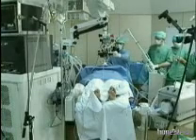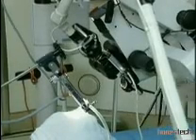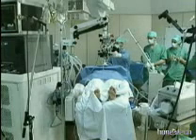The AcuSpot micromanipulator, which is attached to the operating microscope and connected to the laser arm, yields the smallest possible beam diameter, i.e. 250 microns for a focal length of 400 millimeters. In terms of incision, there's no doubt that the AcuSpot has rendered phonomicrosurgery precise and risk-free in terms of thermal damage. But the edges of the incision appeared as slightly dented.